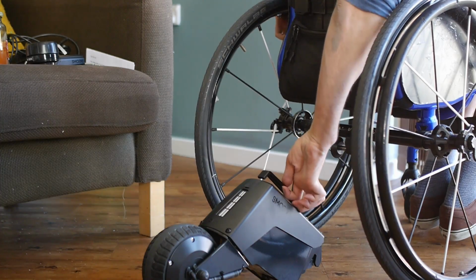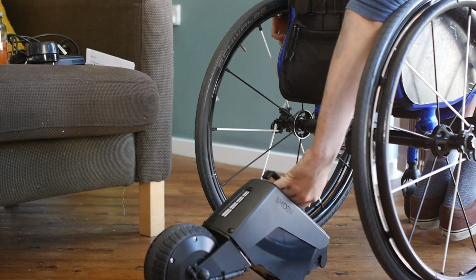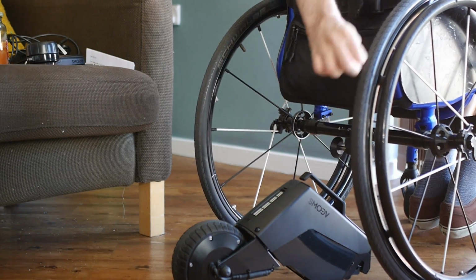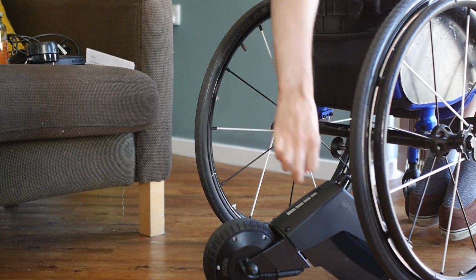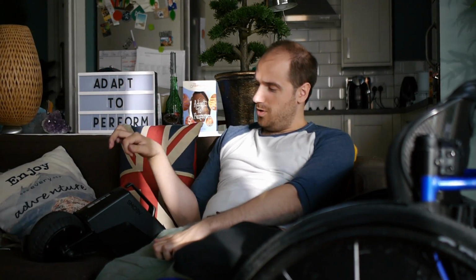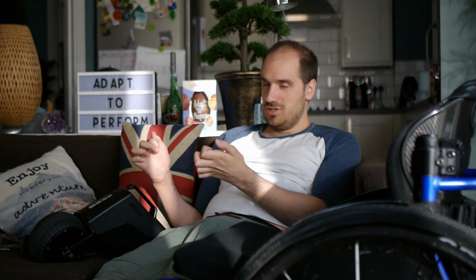The one probably majorish drawback I would say is that it's quite a heavy unit. I did say in the beginning that I didn't think it was going to be too much of an issue, but it was quite difficult to get it on and off the chair and get it on and off the ground. So I imagine this wouldn't be so much of an issue if you had your hand function and you were fairly active and strong, because, and I put here as well, the actual handle here is a little bit uncomfortable to put your hand under, and because I haven't got that grip, I can't quite get it. It slips out quite easily, I found. But that's probably more to do with my disability rather than the actual design of it. It's not ridiculously heavy. It's just a bit on the heavy side compared to maybe what you're used to.